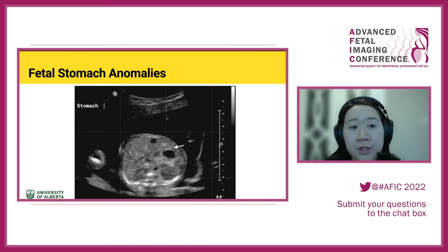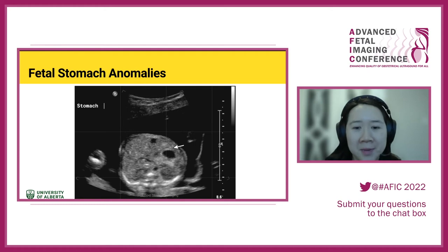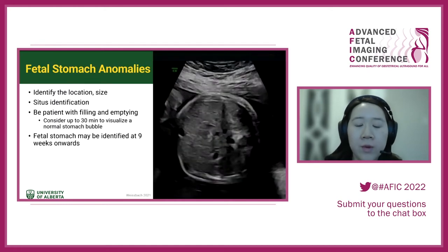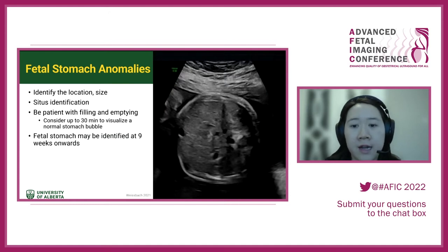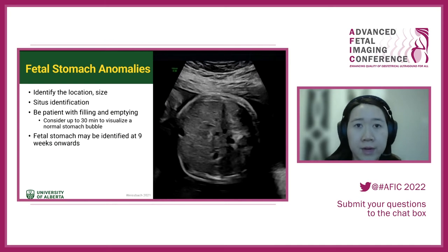Moving on to fetal stomach anomalies — here is a normal fetal stomach, normally placed, normally situated, normal size. When thinking about fetal stomach abnormalities, in this picture on the right there's a very small fetal stomach. Identify the location — is it on the left or right side — and orient yourself to its size.